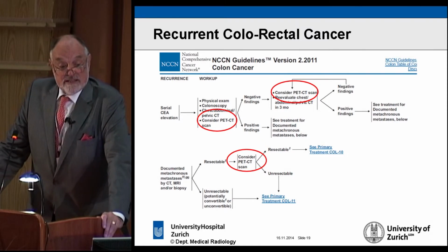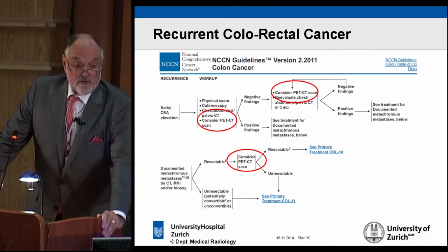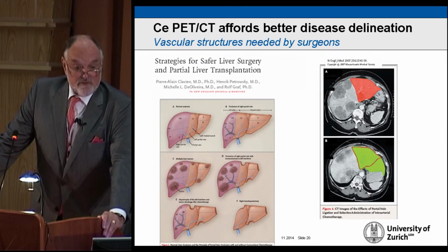However, as you can see here in recurrence, PET-CT is clearly indicated, and the recurrence is very frequently identified by a rising level of CEA.